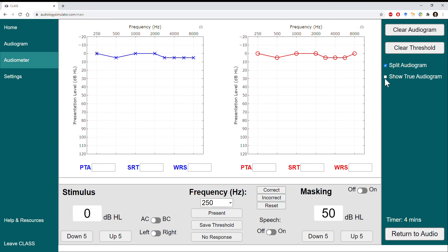When you're in practice mode, you can always check your work by clicking the 'Show True Audiogram' checkbox on the right panel. This will overlay the true audiogram that you're trying to find on top of the one you currently have saved. I can see that there are no deviations for the air conduction or bone conduction thresholds, so I must be on the right track.